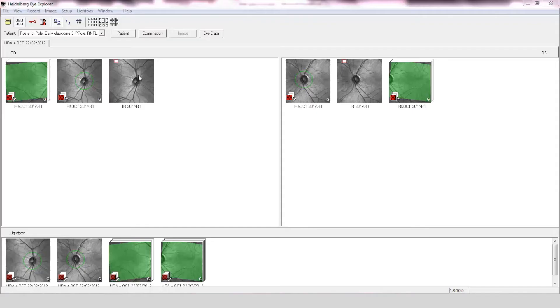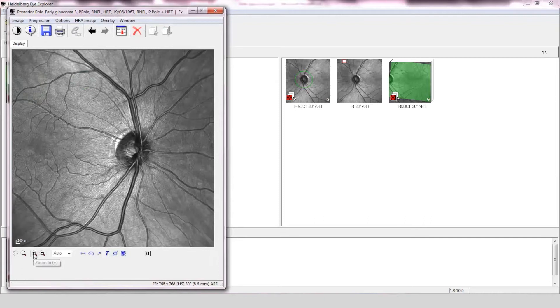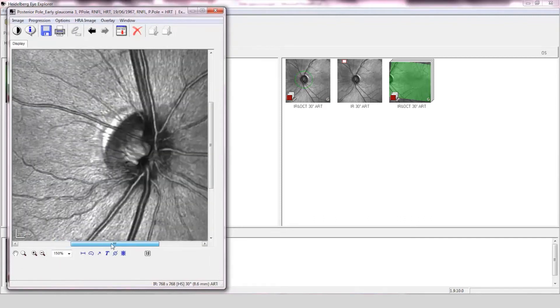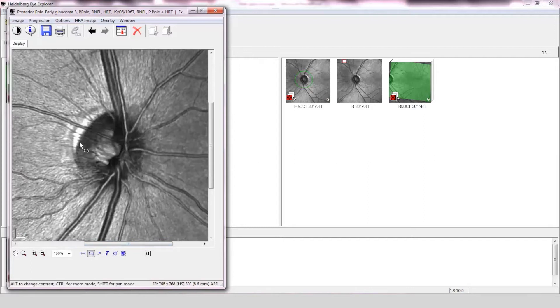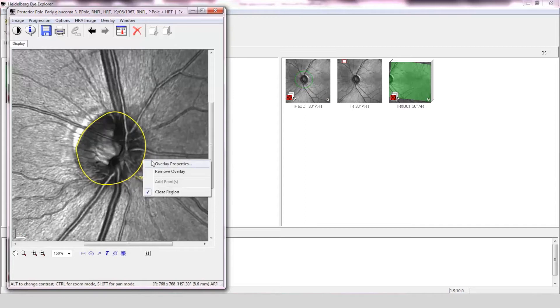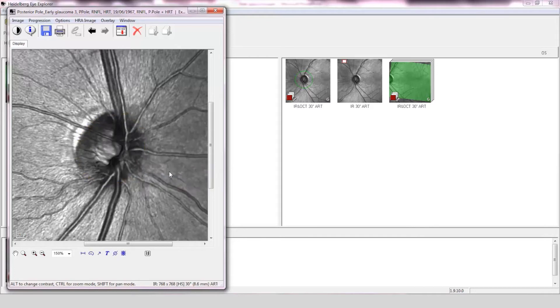Optic nerve assessment of the right eye. The disc is small, approximately 1.76 mm in area. The cup-to-disc ratio is approximately 0.4 and the disc conforms to the ISN'T rule. The reflectivity of the retinal nerve fiber layer is normal.